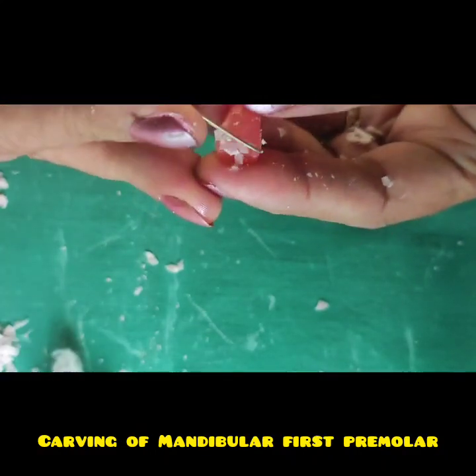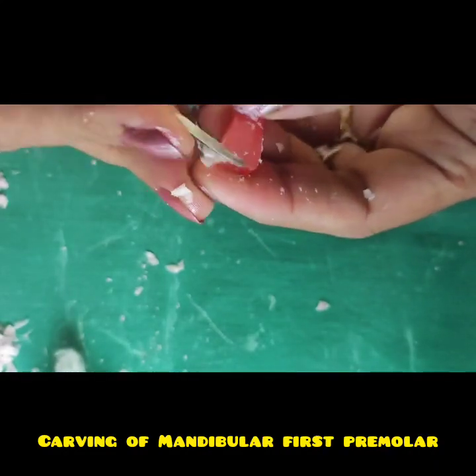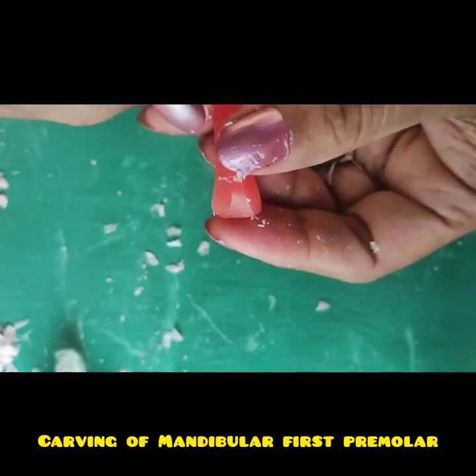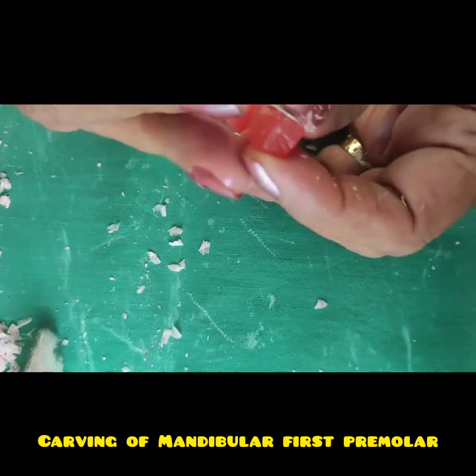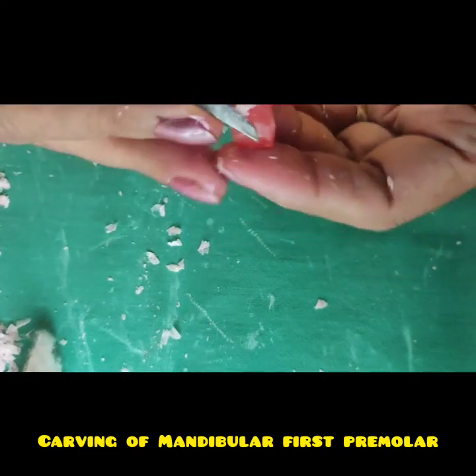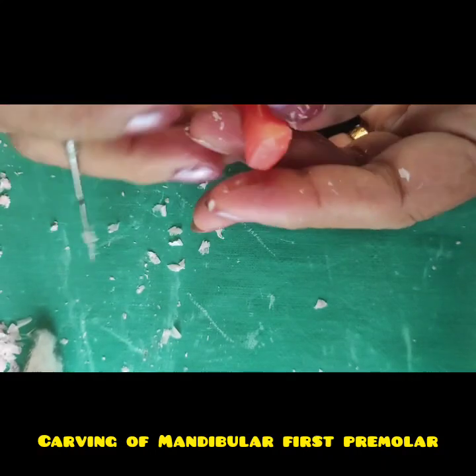So the labial surface will have a nice buccal ridge with an inclined plane like this. Now reduce till you reach the center on the top. Define the buccal ridge after reduction.